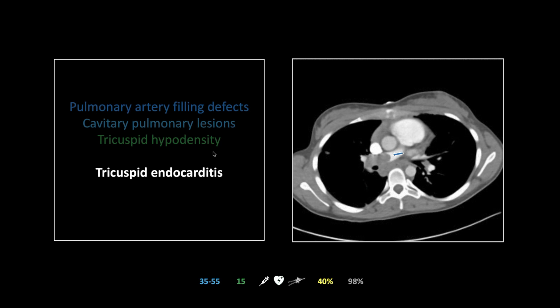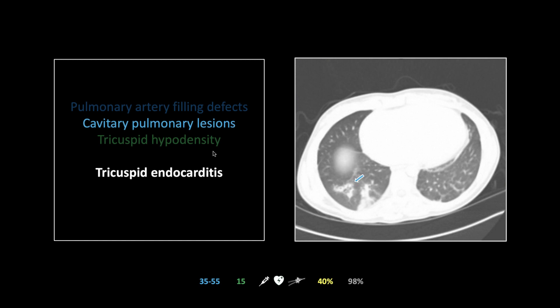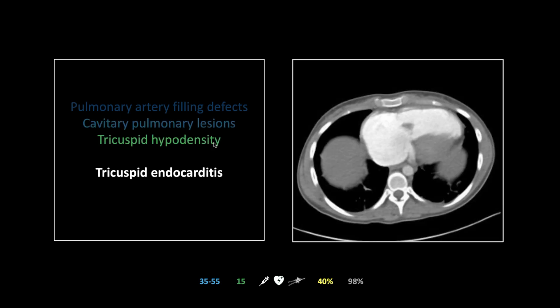There is a huge pulmonary artery filling defect, and here some wedge-shaped and even early cavitating lesions in the right lower lobe — peripheral wedge-shaped, and you can see a couple of little dots of lucency suggesting the smallest of cavitary lesions. On soft tissue windows, there it is — a huge vegetation on the tricuspid valve. Tricuspid endocarditis is more common in the intravenous drug user population. Also note the size of that right atrium — tricuspid endocarditis is almost always associated with dramatic tricuspid regurgitation.